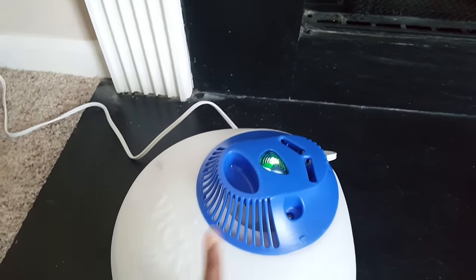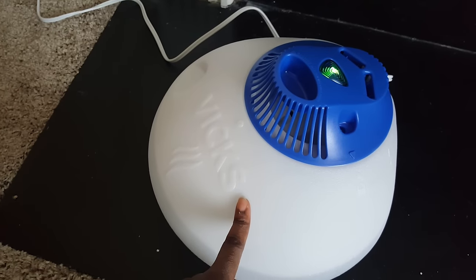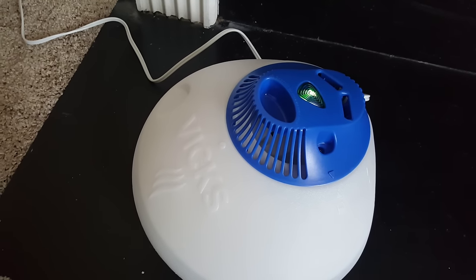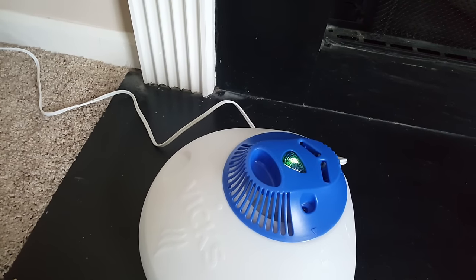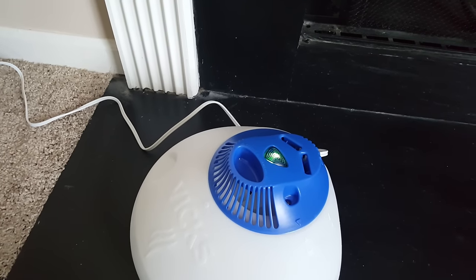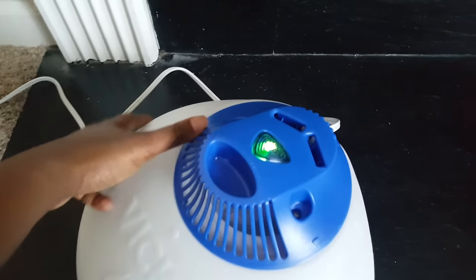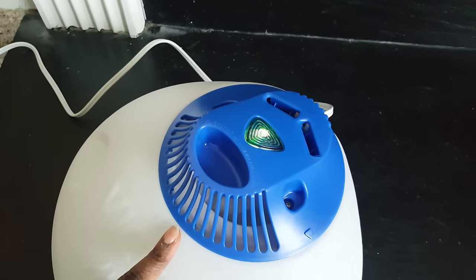The light turned green, and it says that if you don't see any steam coming out of this, you need to add a few pinches of salt. I also want to try using one vapor pad — this is where the vapor pads go. You can use two of them or only one, but I want to use only one.